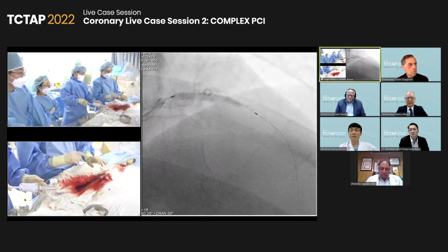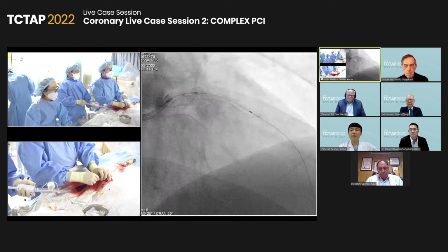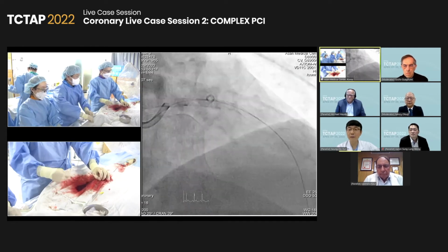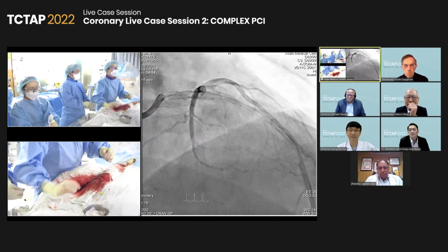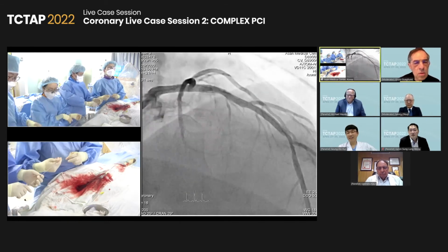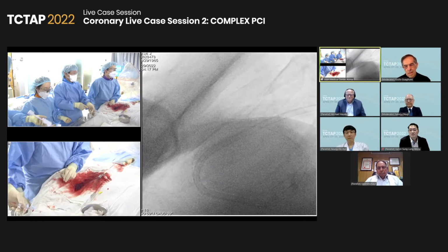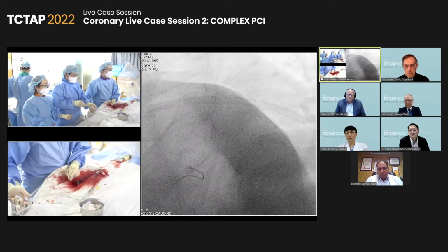Angiographically, the stent looks fully inflated. Let's check the angiography. The distal part has some under-expansion. Yeah, we need further dilation, 3.5, and see. May we ask to have a look in the spider view? Just to have a look at the calcification, how the stent was expanded in a more familiar view. Definitely we need further dilation. And let's check the angio.